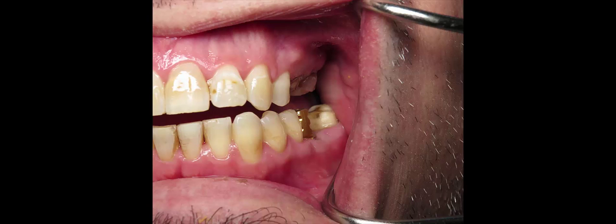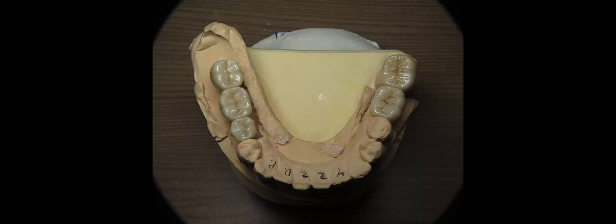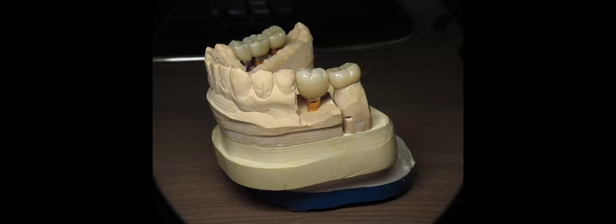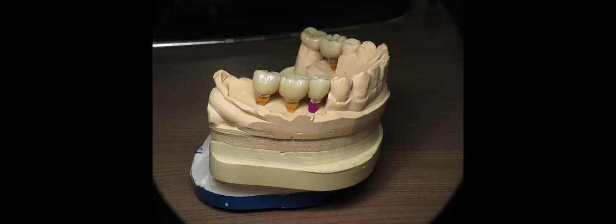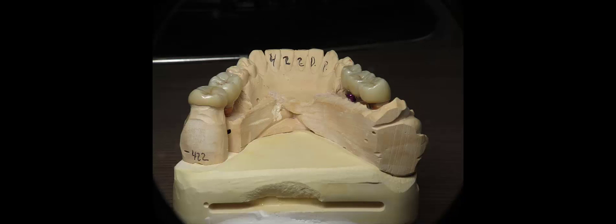At the time, this is done with the traditional molding impressions. We do these actually digitally now with the video scanner. But there are the four dental implant crowns and there's an additional crown on the very back tooth that needed to be replaced. So the best thing to do is to have them all made together.